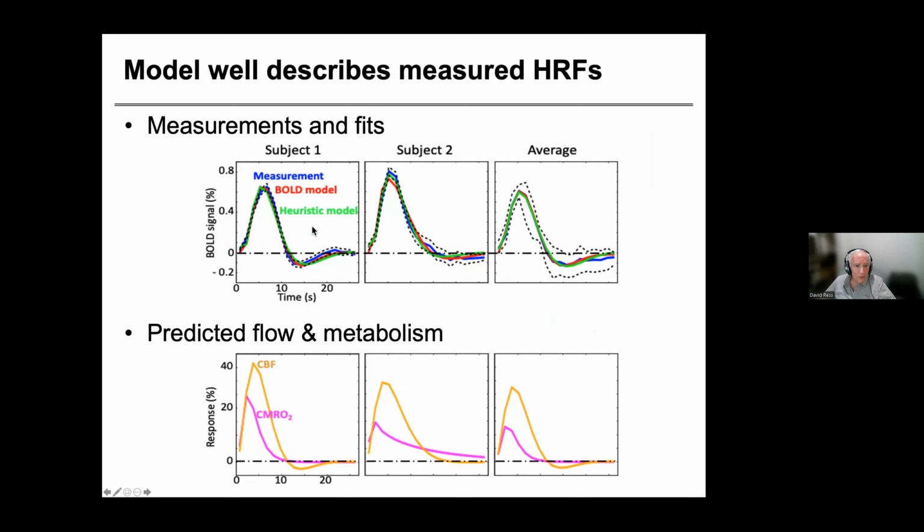If we adopt a fairly high requirement for CNR, peak CNR has to be greater than 3, because we want enough CNR to calculate these temporal parameters, we find that on average, 87% of cortex lights up. This is an average taken from 55 total sessions, where we've run this on a total of 34 subjects. Some of them were scanned more than once.